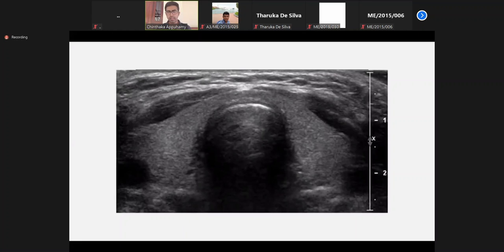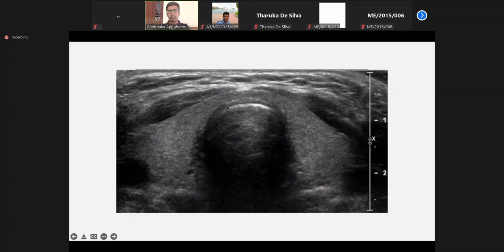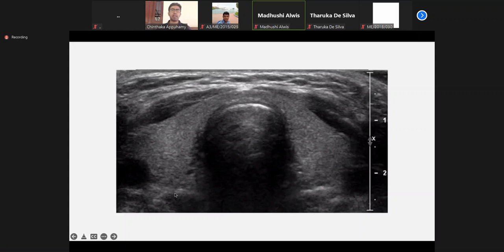This is how you see a thyroid gland when we do an ultrasound scan. This is the normal contour. Can you see my cursor? The thyroid gland is homogenous.